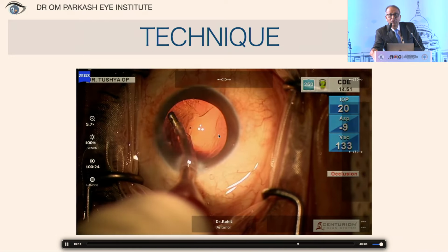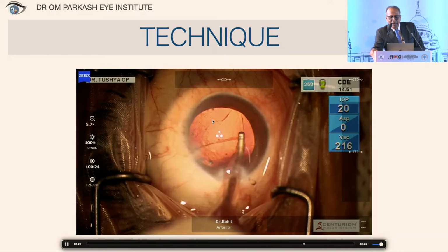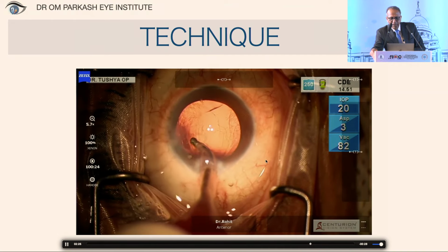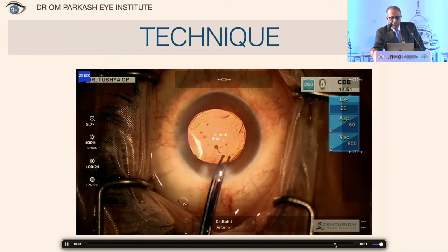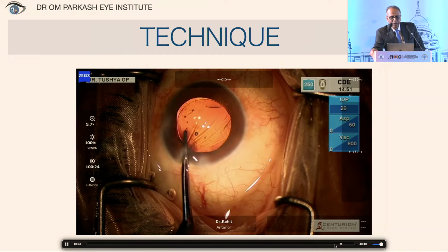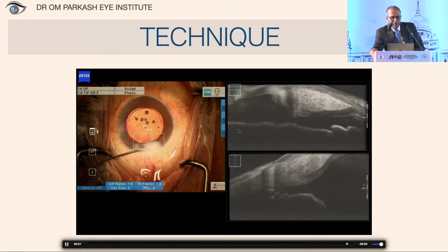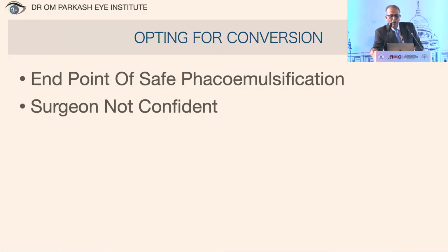And the next thing which I am doing is, you will see the flap is fluttering. I'm taking out the cortex remnant, whichever were there, and the process is again stable chamber settings, intraocular lens implanted, trying to make the rhexis slightly bigger, and while doing stromal hydration, the flap was still fluttering. So now the next thing is: do we always succeed?